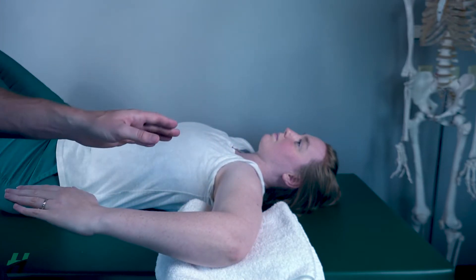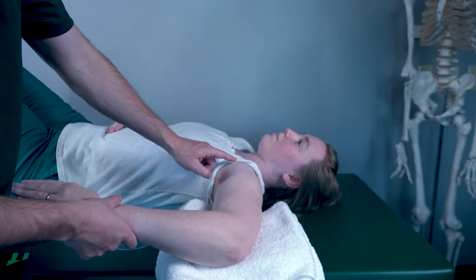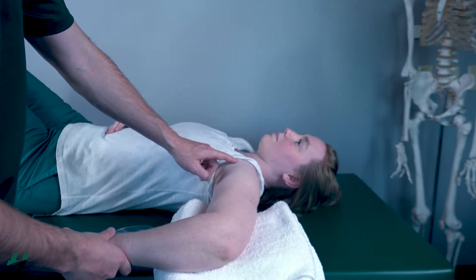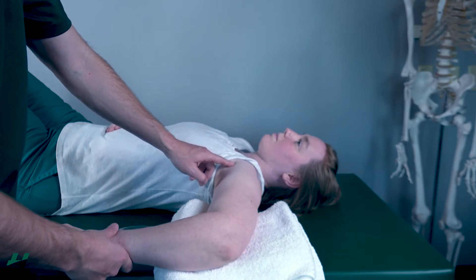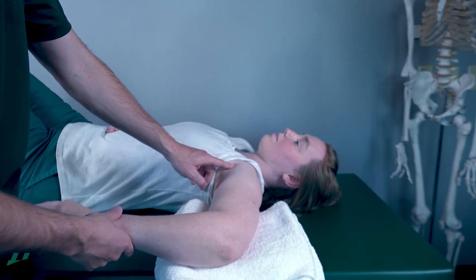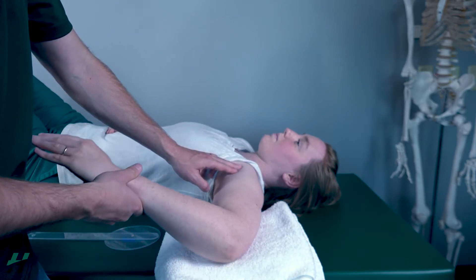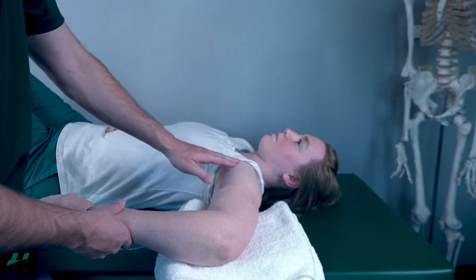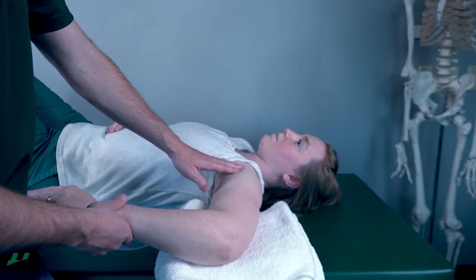Now I want to show you before I measure what to look out for. If I push down on the forearm, you can see the shoulder being hiked. That is compensation allowing more internal rotation at this joint than it actually has. So just look out for that — make sure there's no hiking of the shoulder. What you do is find the position right before the shoulder starts getting hiked, and that is where you measure it.